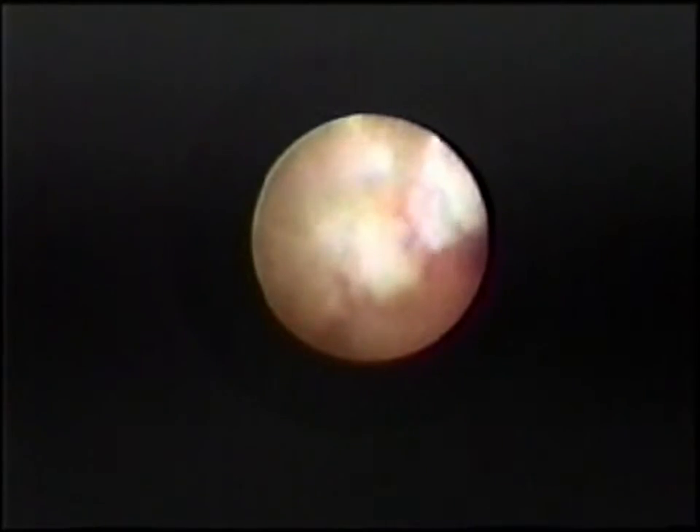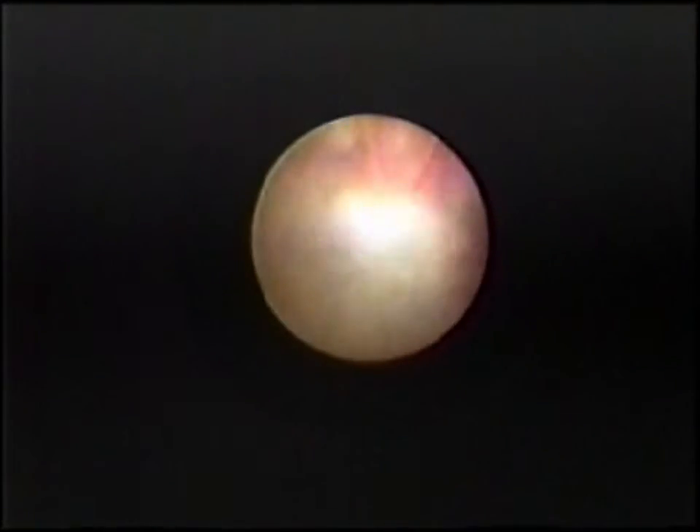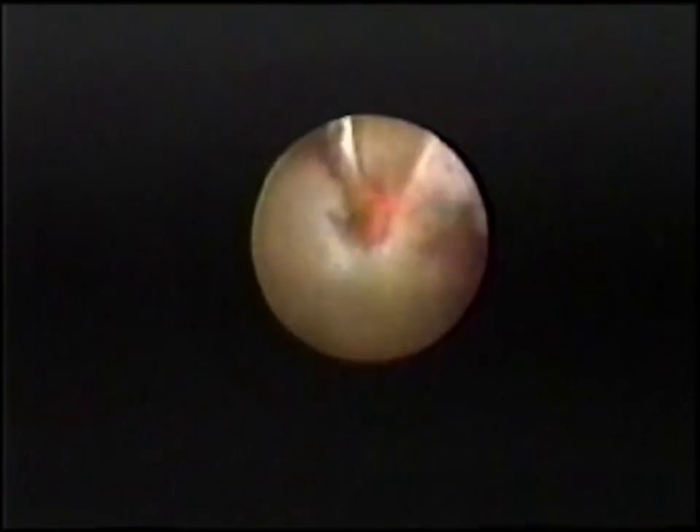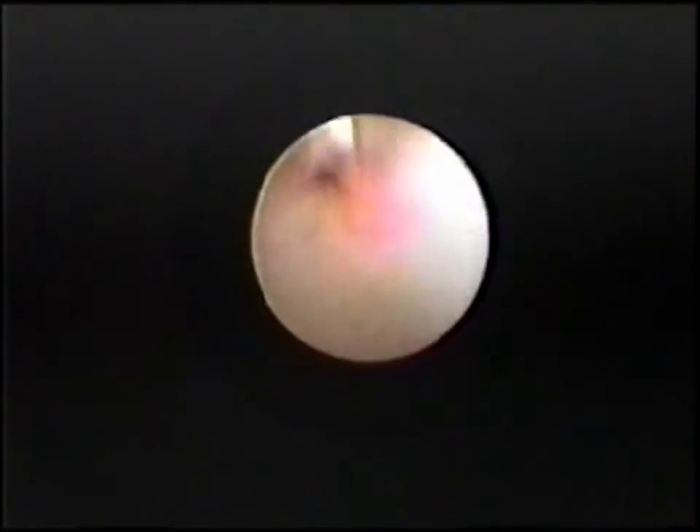There are two ways to advance the laser fiber. One, just move the endoscope forward. Two, you can turn the laser fiber advancement knob at the rear of the laser endoscope handle clockwise. Using this knob, you can position the laser fiber from one to six millimeters from the endoscope's distal end. Remember that the distal end of the endoscope is radio-opaque, so on fluoroscopy, the laser fiber can extend up to an additional six millimeters. Don't bury the laser fiber in tissue — that can lead to overheating.